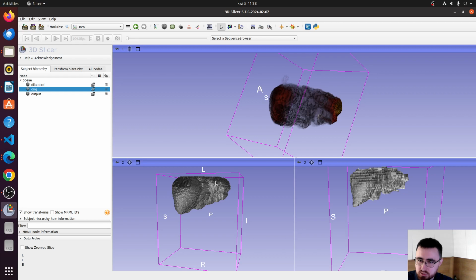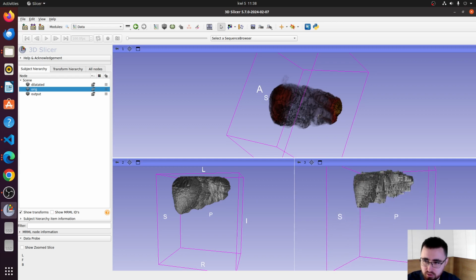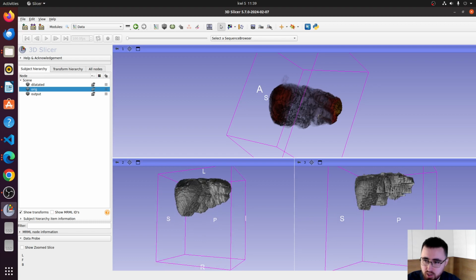Why is it so? Let's look at the images. If we look, for example, at the hilum, in this area, the dilatation would not lead to very big changes in the Hausdorff distance because there are a lot of irregularities in this area. So by dilating, we mainly smoothen out those irregularities. We always have some voxel in some area that is close to the dilated image, yes? Because something sticks out.